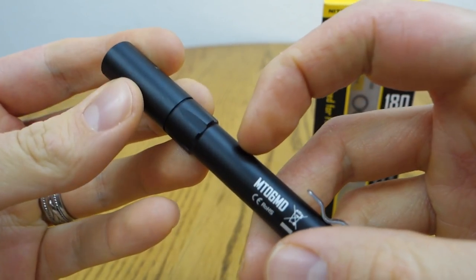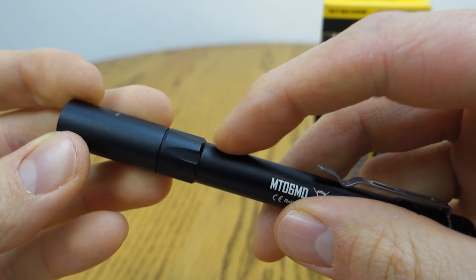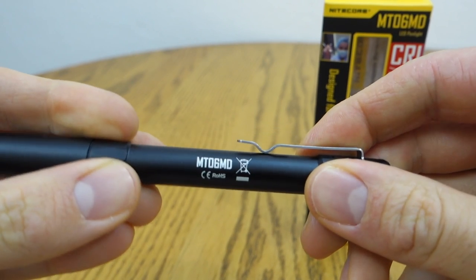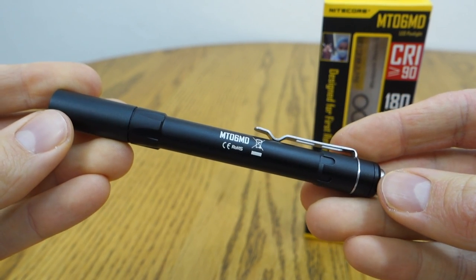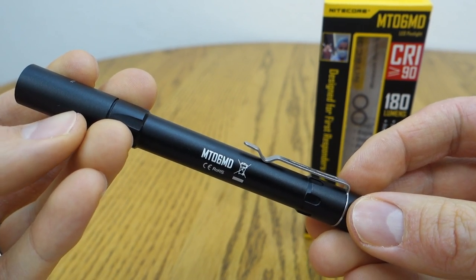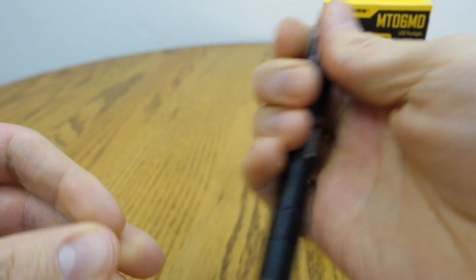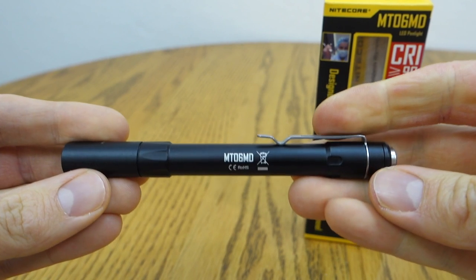In regards to the body construction, the finish is a hard anodizing type 3, which is really great — these flashlights are always being dropped and they're very scratch resistant. The machining finish on the outside feels a little unusual at first with kind of a ridge to it, but it might actually provide extra grip, especially when using examination gloves or nitrile gloves. It would have been nice to have a little extra knurling — something towards the end where you hold it with a finger and a thumb would have been nice for a firmer grip.